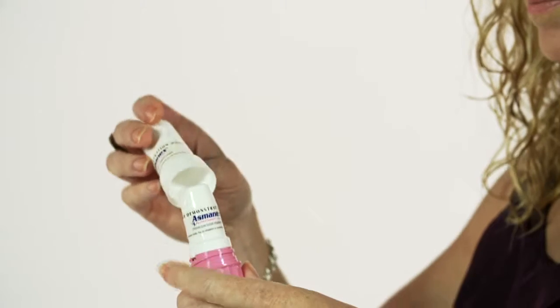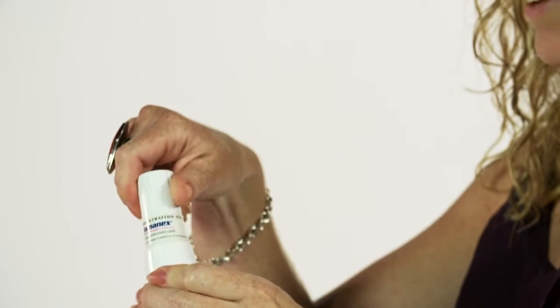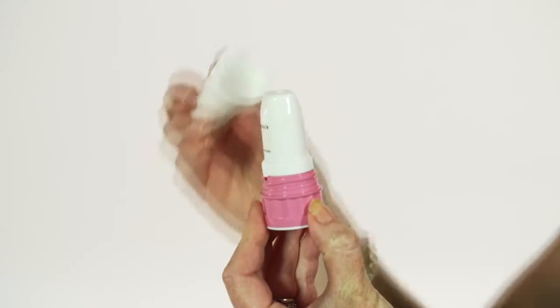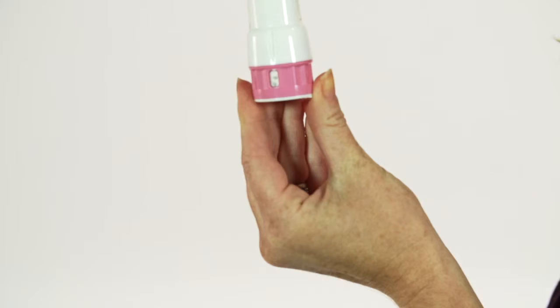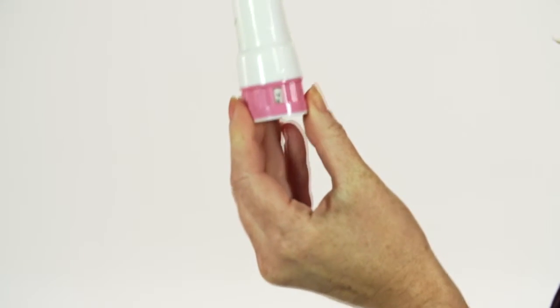Wipe the mouthpiece with a clean cloth to remove any moisture. Promptly replace the cap — press it downward and twist it clockwise until a click is heard. The arrow should line up with the dose counter if it is properly closed. Replacing the cover not only protects the device from debris but sets up the device to load the next dose.